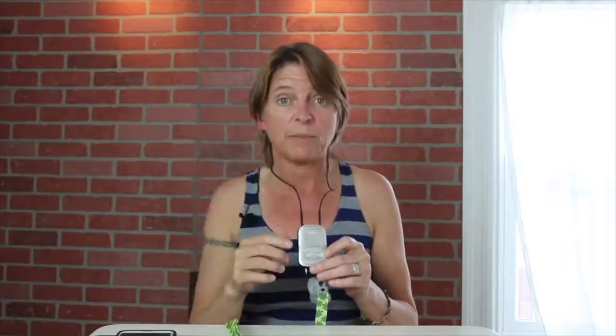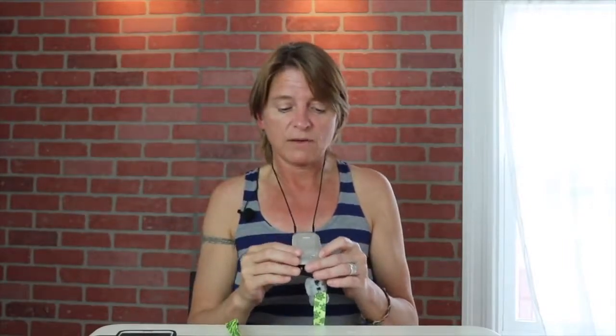This setup gives me direct audio streaming to my ears. The stethoscope signal travels through the wire to my streamer, and it automatically goes directly through to my hearing aids via my hearing programs — which is really a great feature.